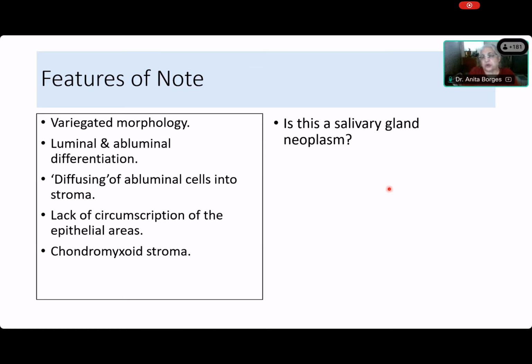Why do we ask this question, Shivani? You didn't understand why we asked this question. Somik, why do we ask this question? Madam, first to exclude whether it is primary or from any metastasis. And the other thing is the involvement of the lymph node. Okay. Madhu, you want to explain? Ma'am, because here we can see the normal salivary gland cells like luminal ductal cells and abluminal myoepithelial cells, and there is myoepithelial cell differentiation and a chondromyxoid stroma.